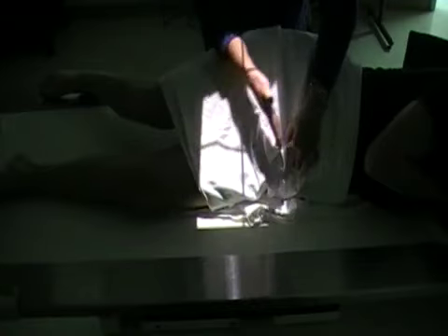And when we do a lateral femur, we're going to have to do this in 2 parts. First we're going to include the hip joint. Okay, so I've got a 10 by 12 loaded in, and I'm going to palpate the ASIS at the top of the light field at the ASIS.